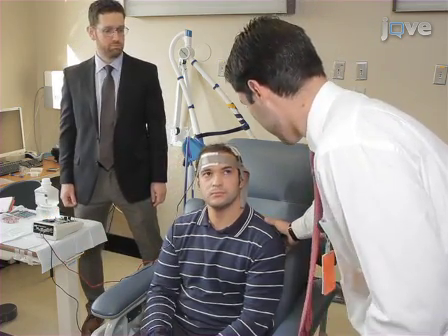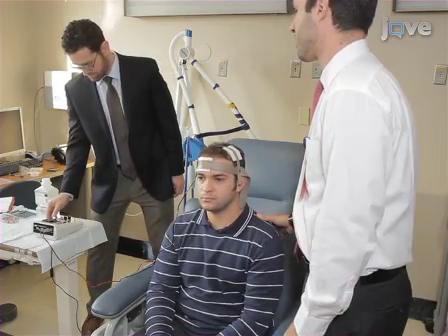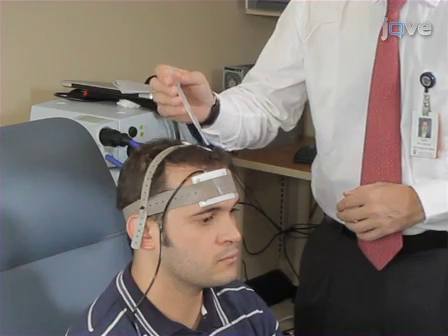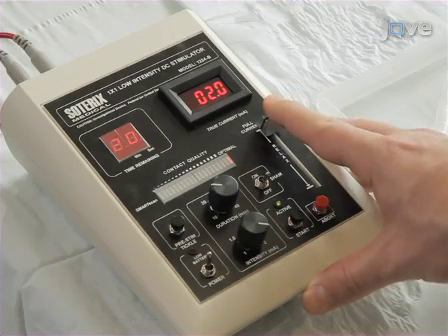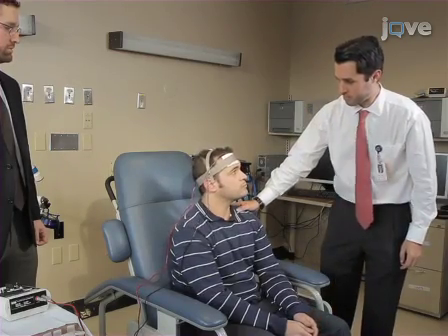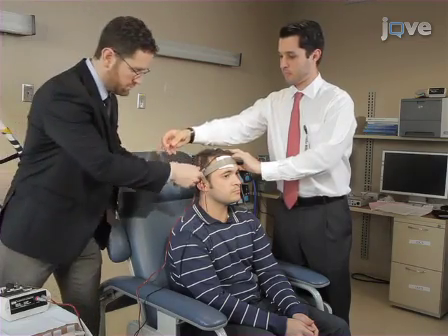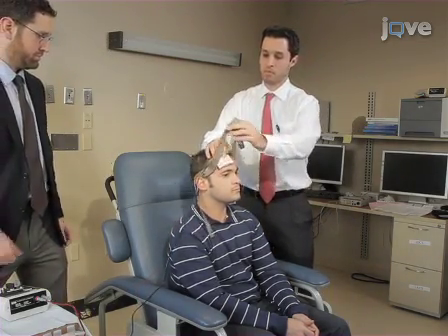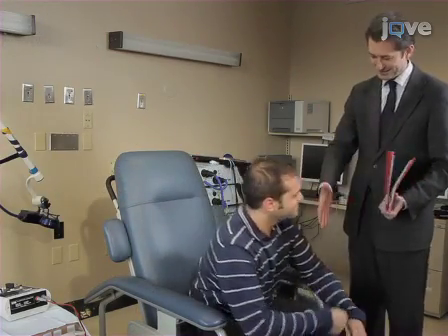Assure the subject remains comfortable, and be sure to watch for sponge movement and dehydration during stimulation. Use a syringe or pipette to add more solution if needed through the course of the experiment. When the experiment is complete, the current flow should be ramped off as well. Most subjects usually continue feeling some local sensation even after current is discontinued — inform your subject that this is not unusual. Finally, remove the electrodes and straps, and answer any final questions the subject may have before leaving.